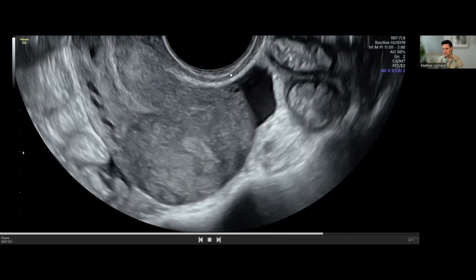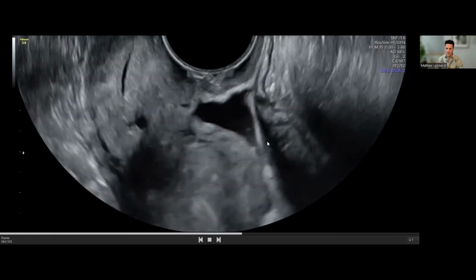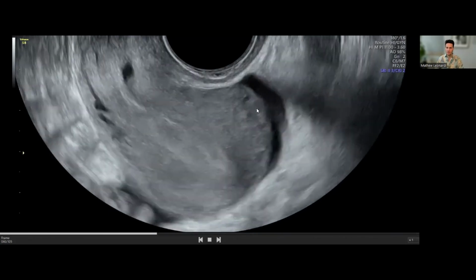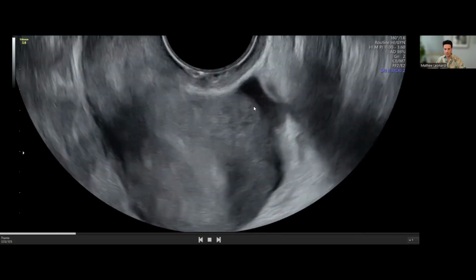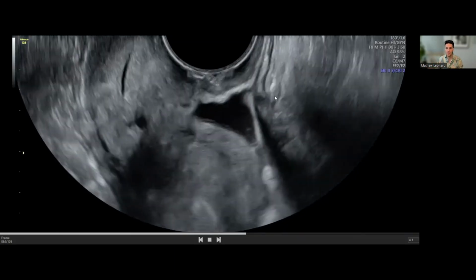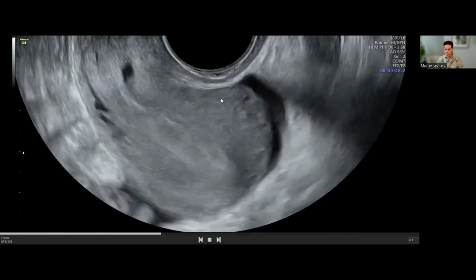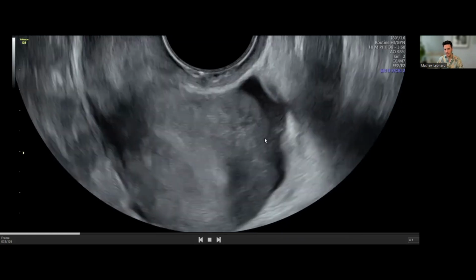When you see this amount of fluid here, almost covering the entire posterior aspect of the uterus, the pouch is non-obliterated, really. You can have partial obliteration in some cases, and so you really do want to check laterally as well, especially when you have uterosacral ligament endo. So you want to check in that area, but this uterus is definitely falling off the back of the vagina really nicely, as well as sliding along the bowel.